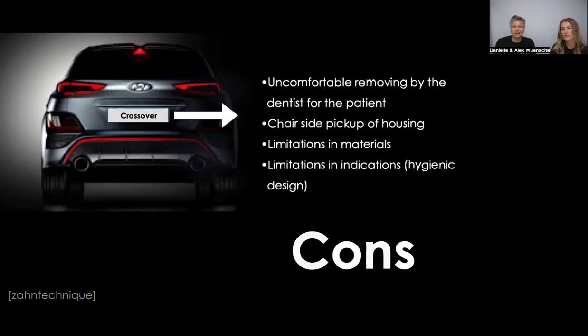On the con side, though, I mentioned already, it's uncomfortable to remove. And I wouldn't say necessarily a con, but maybe for some of you guys, you would see it as a con, is the chairside pickup. If you don't do it on a regular basis, you have to be comfortable with picking up attachments chairside in the mouth and do it on a regular basis.